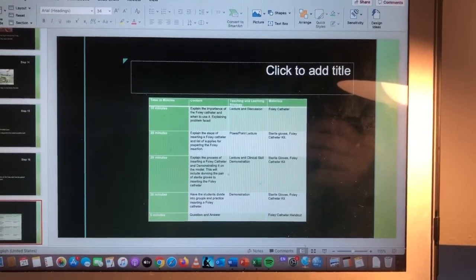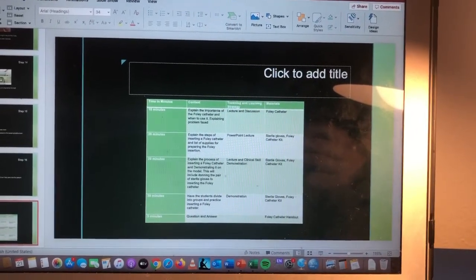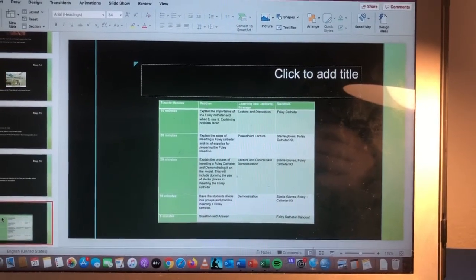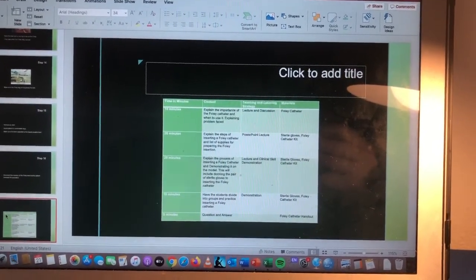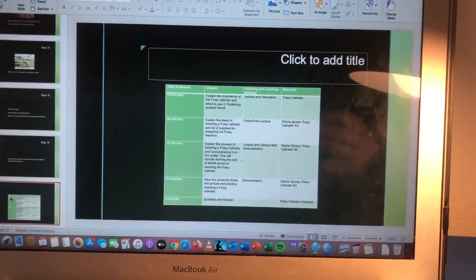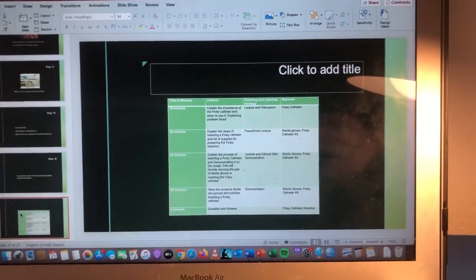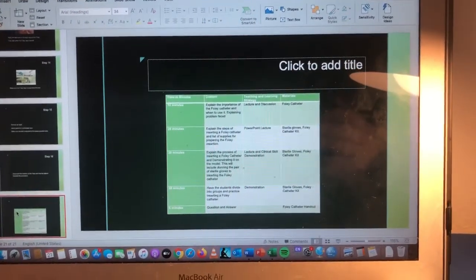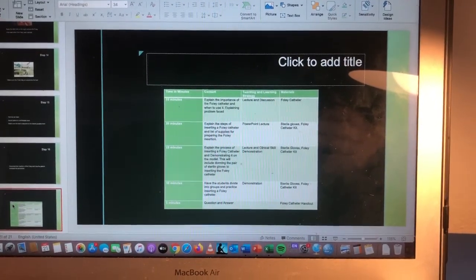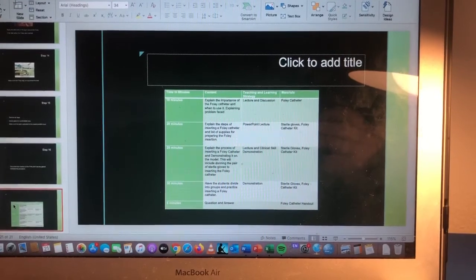So this will complete the lesson plan for teaching how to insert the Foley catheter. I would say in a week or so, there will be a check-off list in which each student has to perform inserting the Foley catheter to be competent in their skill.